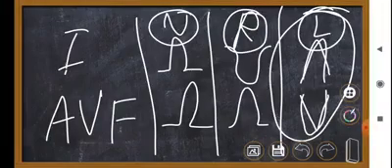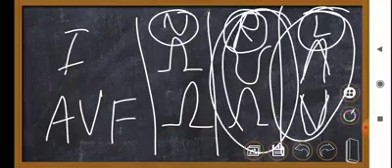And the opposite is definitely right axis deviation. They are facing each other and it seems like they are approaching each other, so it's right axis deviation.